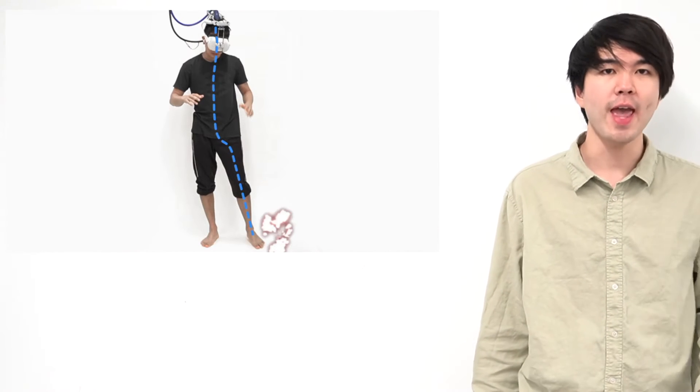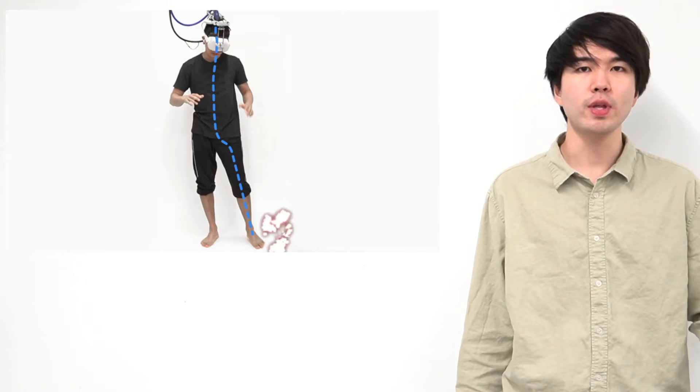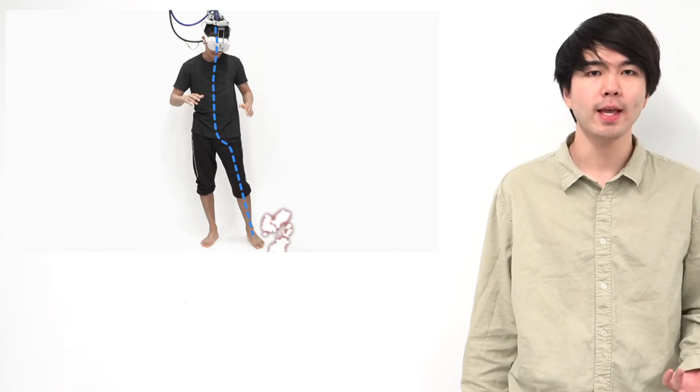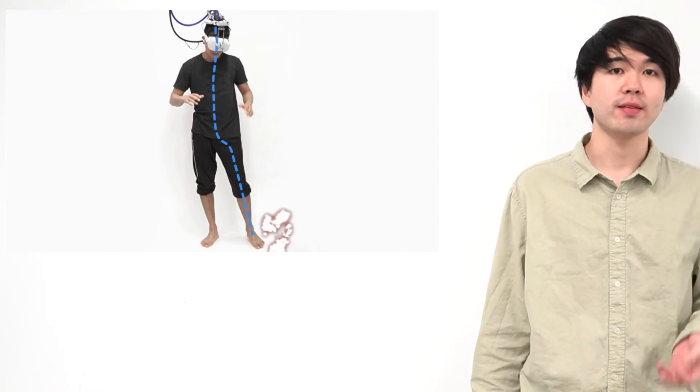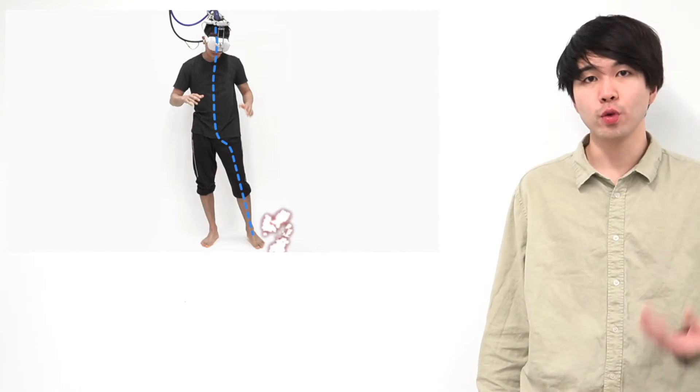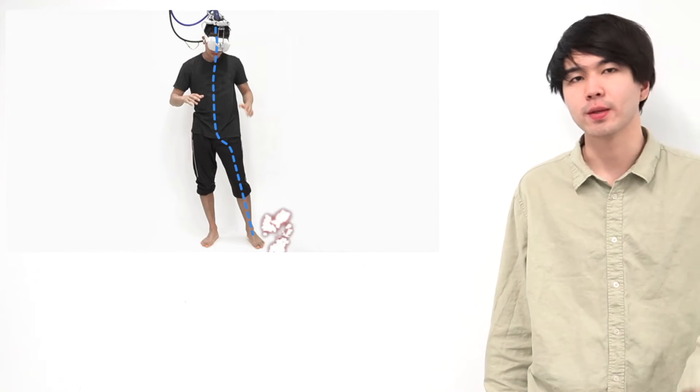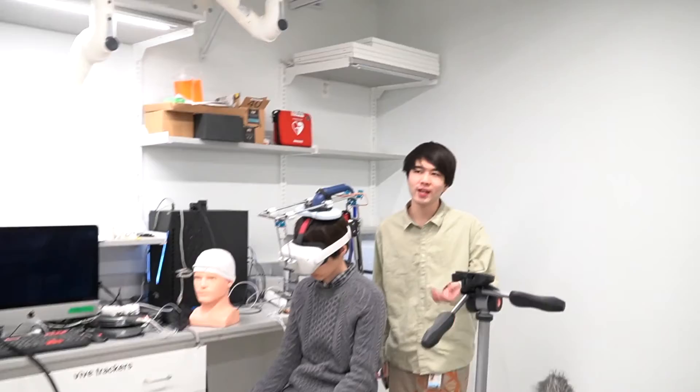As you have just seen, this single device on the user's head was able to switch between two areas, the hand and foot, and generated sensations, although these two points are very far apart. And again, he wears nothing on his hands and feet.